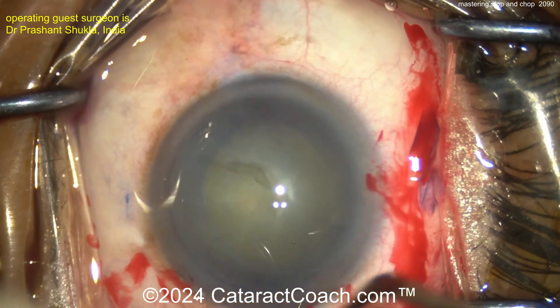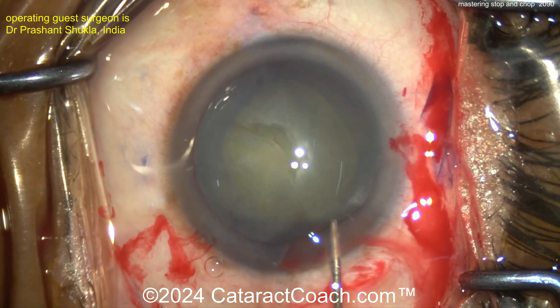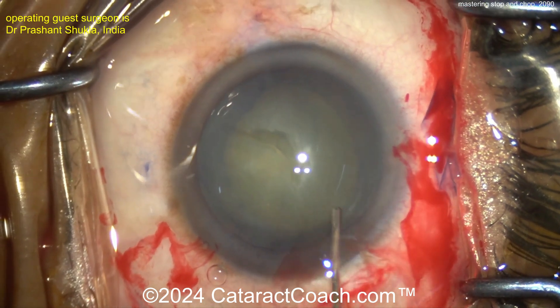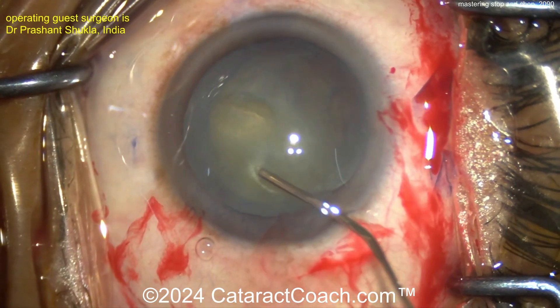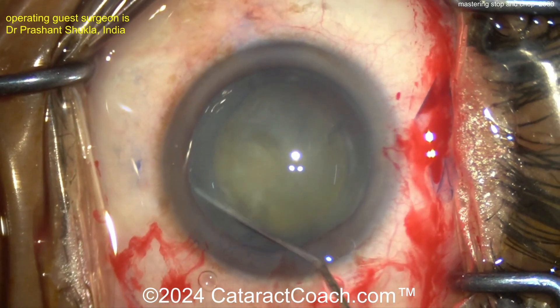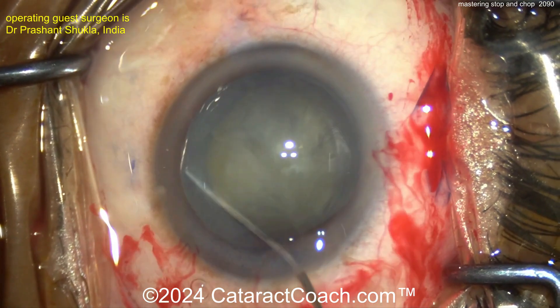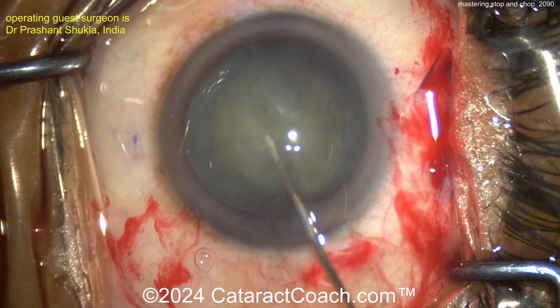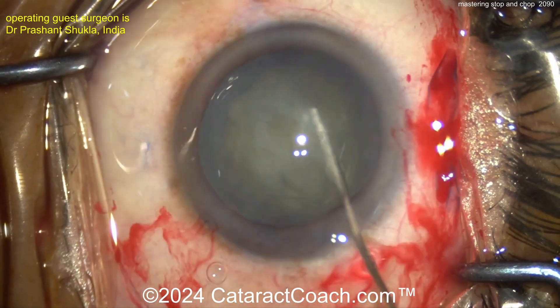Stop and Chop is a technique where a single groove is created down the middle of the nucleus. It is then split into two halves using a cracking technique, and then each half is further sub-chopped. There's Divide and Conquer, which is making all four quadrants with just the grooving and sculpting method and then cracking. And then there's Chop, which is just no grooving or sculpting, just immediately chopping into quadrants. This is a mix of the two: Stop and Chop.